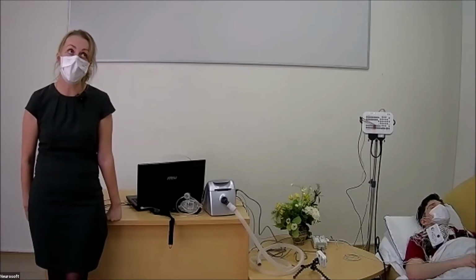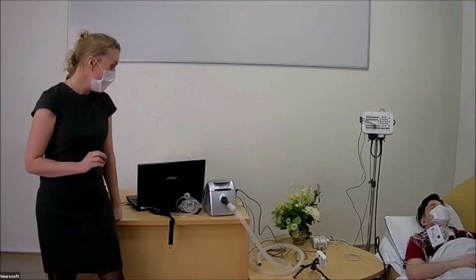Last time I described several ways we can transfer information from the PAP devices to our system. And now I'm going to show you several ways of it. I've said that the first way we can perform this test is to put the pressure value into our software manually, and we use the pressure markers for it.